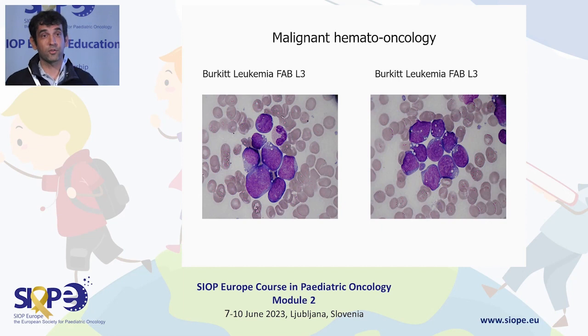Here's L3 morphology. This is something you should all know because it's an emergency situation. When this patient comes in on the weekend, you cannot wait until Monday to make a diagnosis. It is important to recognize this because L3 patients are treated completely differently than typical ALL. You have this blue cytoplasm, very typical, with these vacuoles.